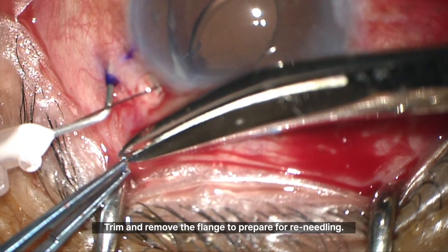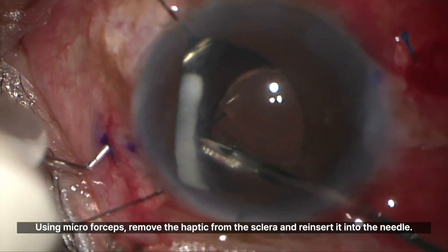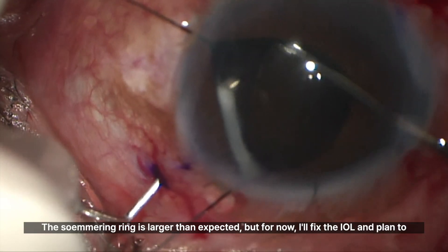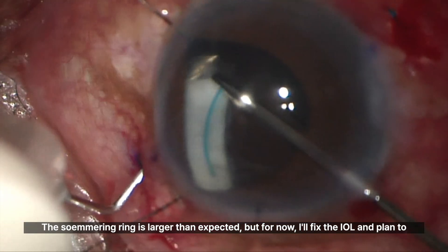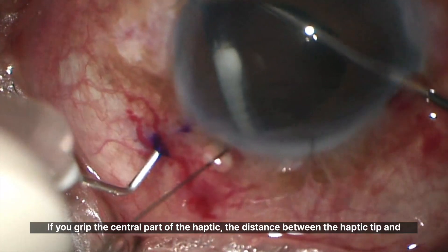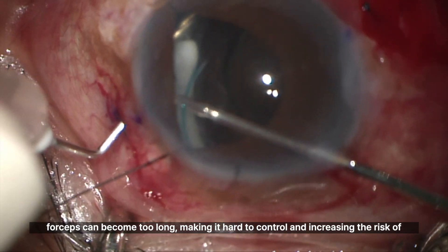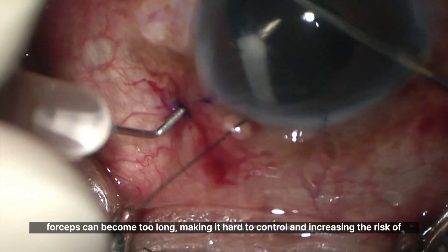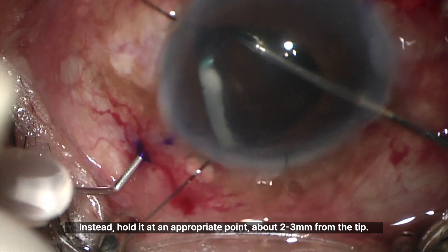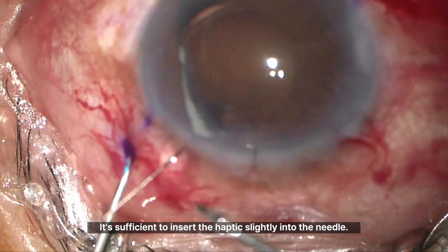Trim and remove the flange to prepare for re-needling. Using micro forceps, remove the haptic from the sclera and reinsert it into the needle. If you grip the central part of the haptic, the distance between the haptic tip and the forceps can become too long, making it hard to control and increasing the risk of breaking the haptic. Instead, hold it at an appropriate point, about 2-3mm from the tip.